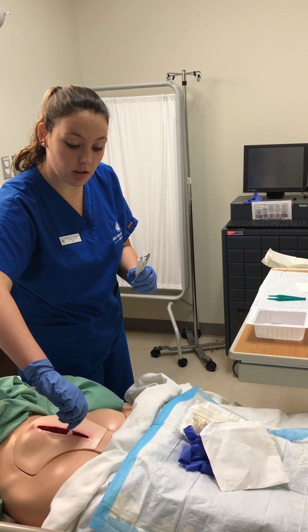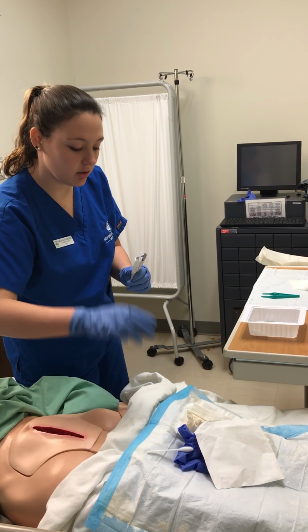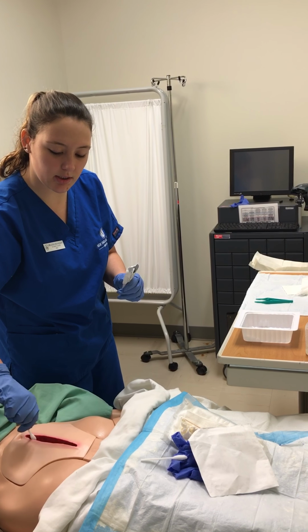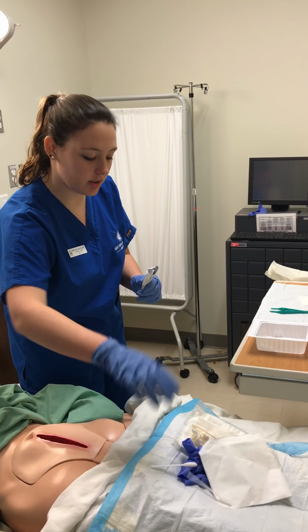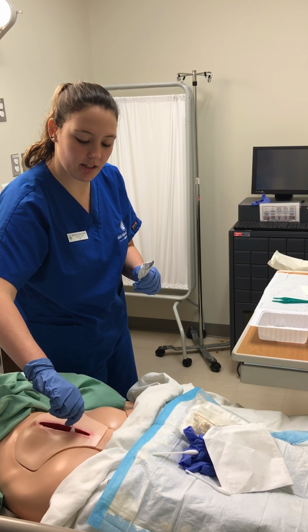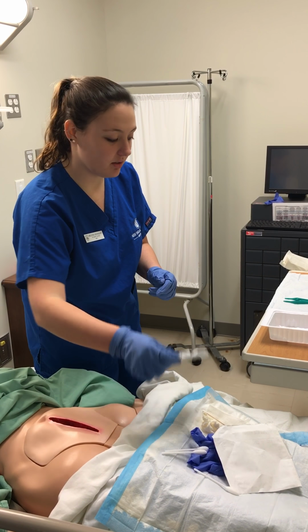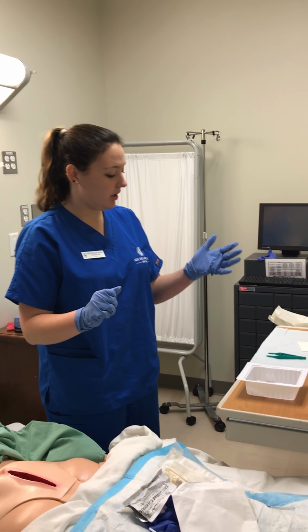So you want to do a twirling motion down the middle, discard, and you're going to do the same twirling motion towards one side, top to bottom, discard, and then same thing just on the other side. Twirling motion top to bottom. Okay, now I'm ready to pack the wound.